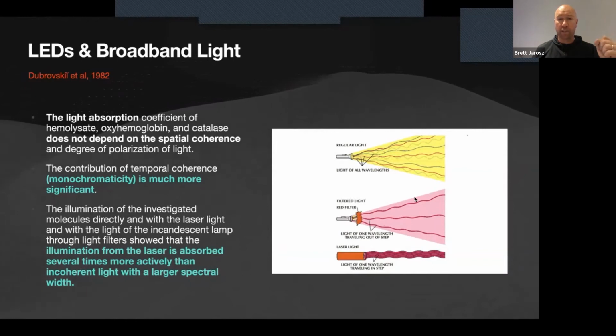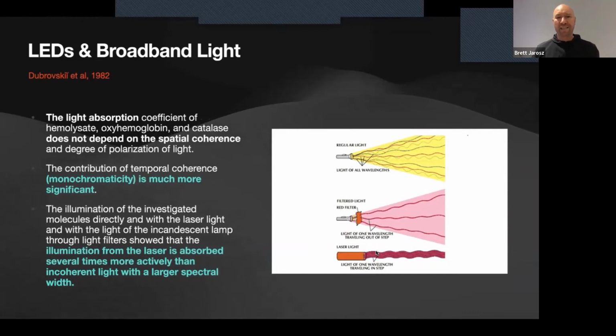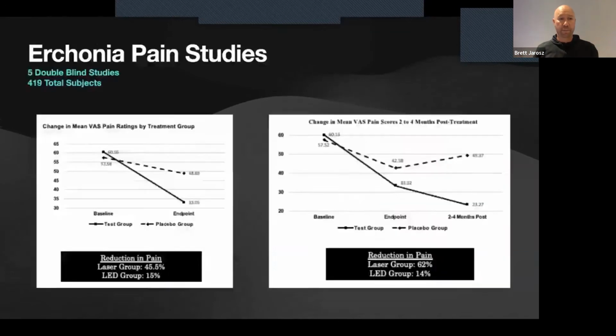Does LED still work? Yeah, we've talked about it. We'll review that again. LED works. It's just that laser, having that very narrow directionality to it, is absorbed by the tissues. And we said absorption is the key when we're using light therapy. Scatter is what basically wastes the opportunity for those photons to be utilized.